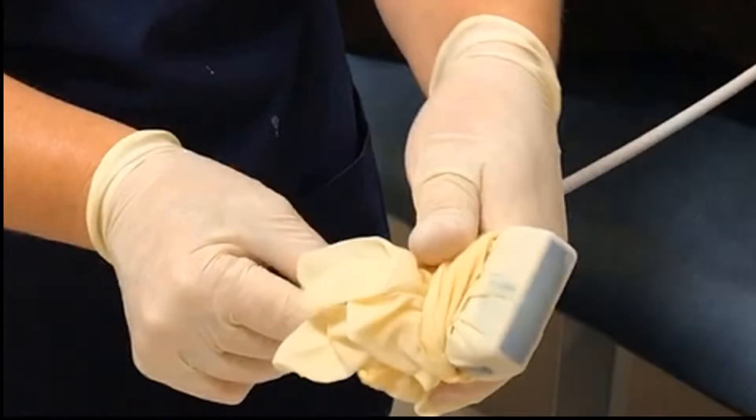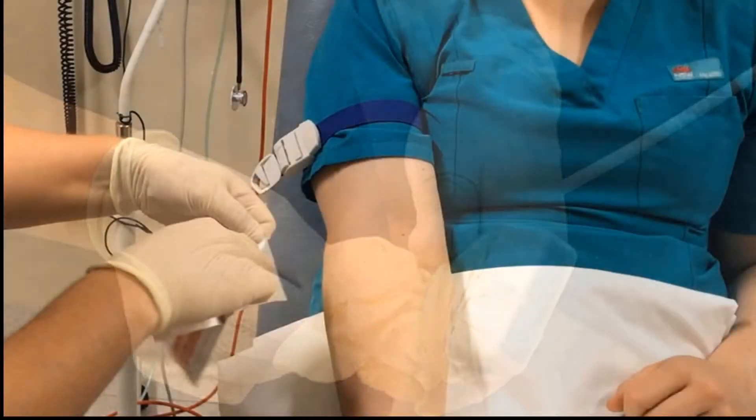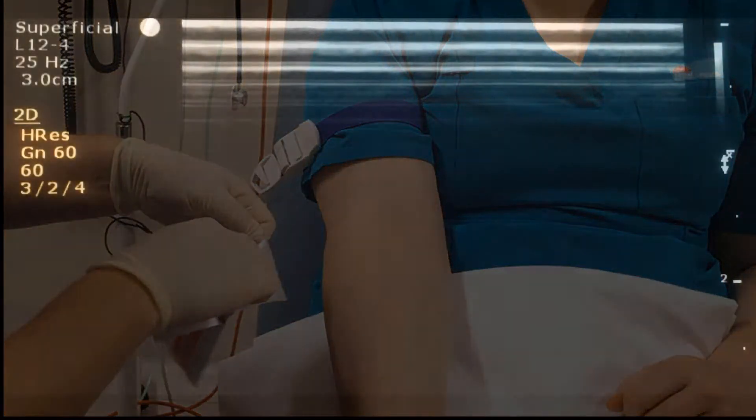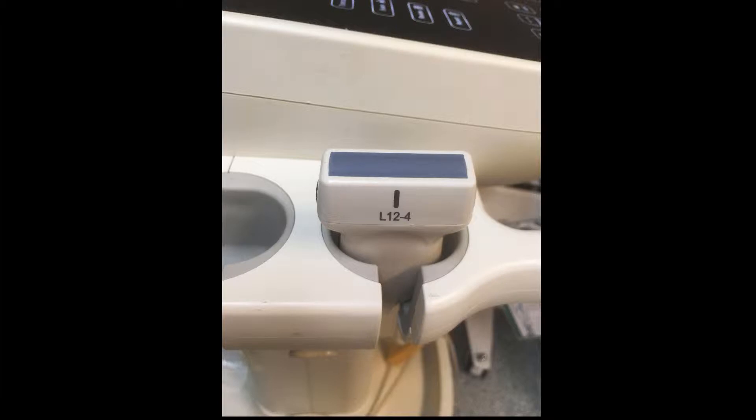In this video, we're going to look at the insertion of a peripheral cannula under ultrasound control using a sterile glove technique. The patient should be comfortable with their elbow ideally rested on a stable flat surface. The ultrasound machine needs to be preset to vascular access or superficial, and you'll be using a linear high frequency probe similar to this.